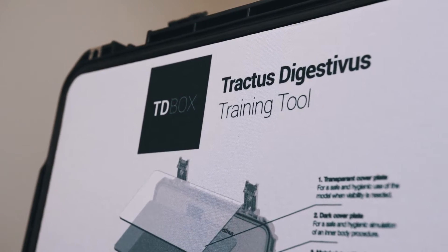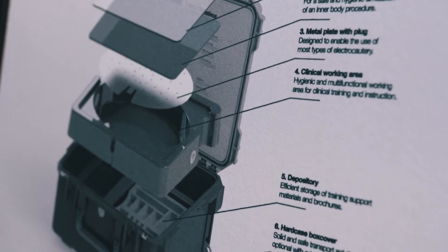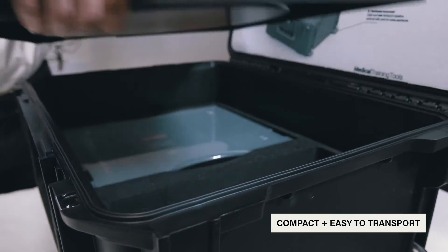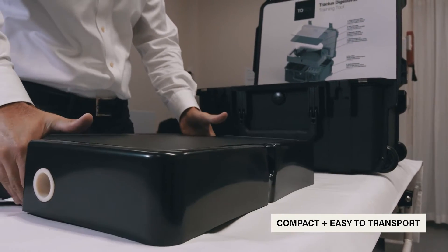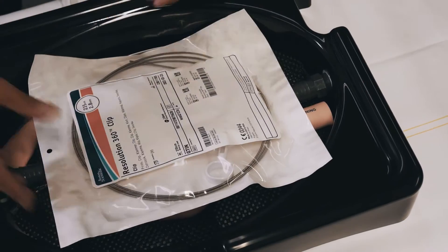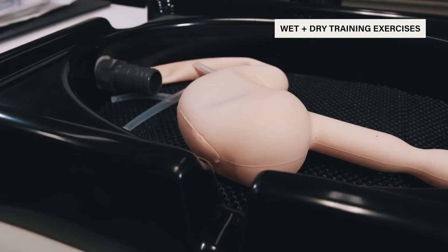The Tractus Digestivus Box, or TD Box, is designed for hands-on endoscopy training. It consists of a compact and easy-to-transport case containing useful storage spaces and a design-for-purpose training platform suitable for both wet and dry training exercises.